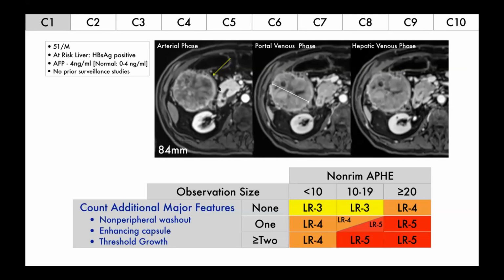And now what I would look for is the other features. The other features are, is there any washout? Yes, there is washout. And plus, what else do you see? Is there an enhancing capsule which is persisting?